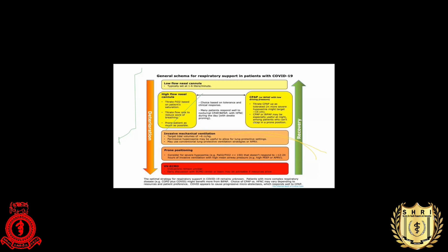Regarding the ResMed CPAP machine, the older version does not have an FiO2 sensor, so you can't check it. You have to go clinically and by the flow rate. Some newer versions have an FiO2 sensor and FiO2 reading as well. It depends on the model, so you can go through the model leaflet or booklet, and if it doesn't say anything about FiO2 monitoring, that means you can't.